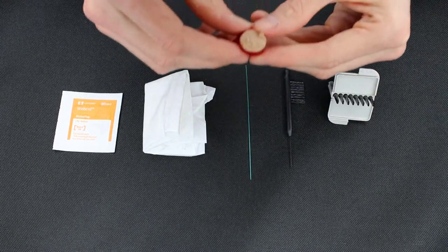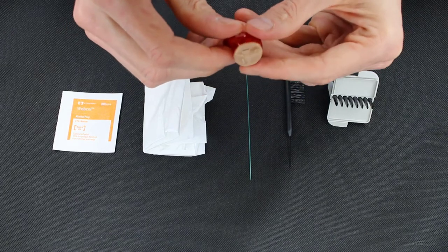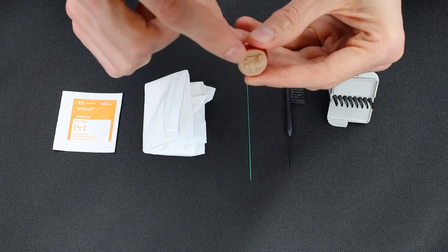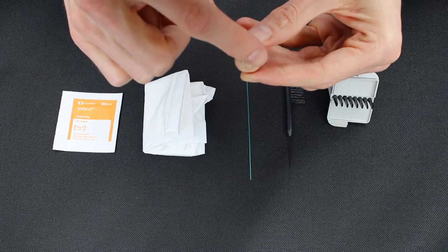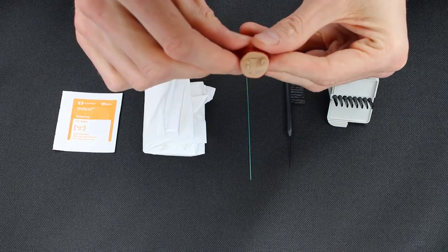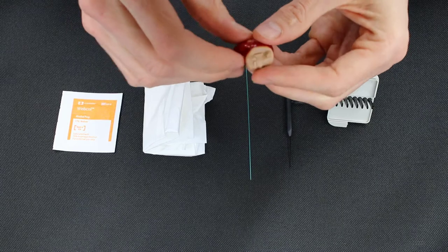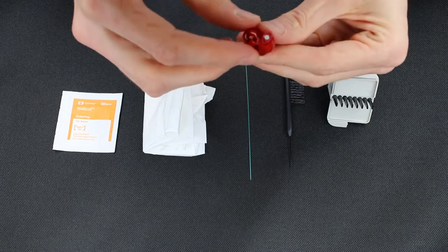For an in-the-ear device like this, we have a few things that we need to keep in mind. This part right here in tan color is essentially what's gonna be showing outside of the ear, and then everything in red is the portion that goes inside of the ear.